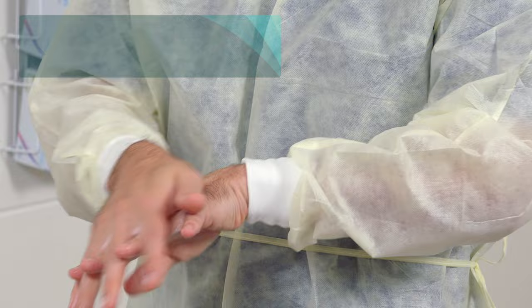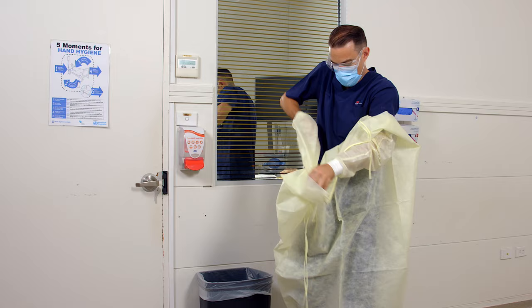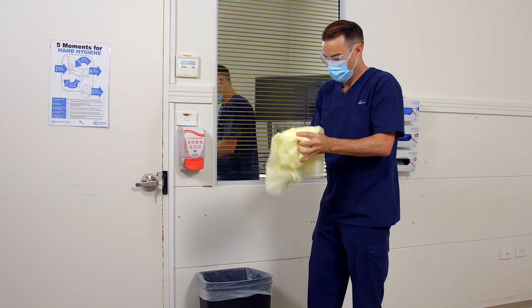The next step is to remove your gown or apron. Untie the straps of the gown and pull the gown away from you. Roll it inwards and downwards, making sure you bend forward slightly to reduce self-contamination. Discard the gown into the general waste bin.